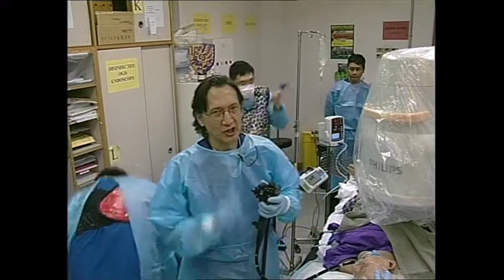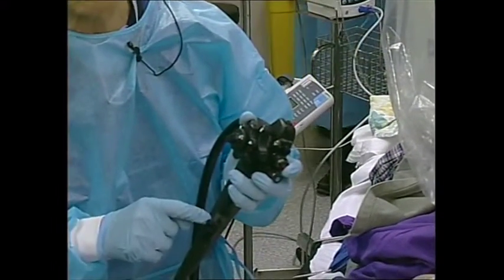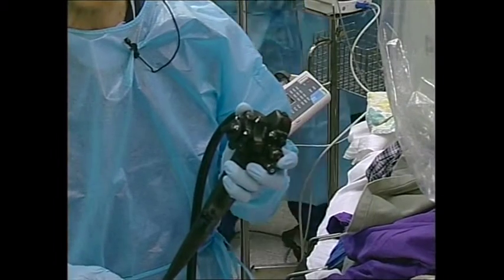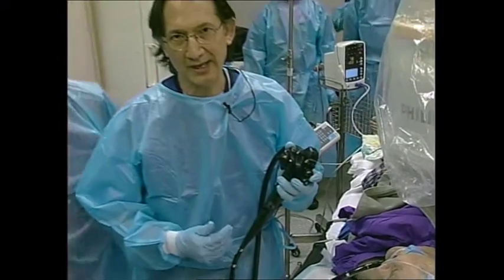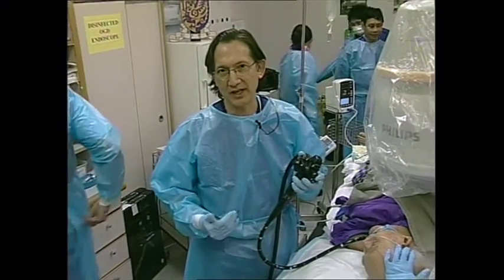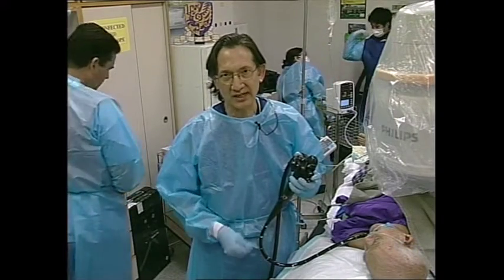Good afternoon. I just inserted the echoendoscope, and this is a therapeutic curved linear array echoendoscope. The reason why we've selected the therapeutic with the large channel, it's 3.7 millimeters, is because we may be inserting a stent to internalize his gallbladder drainage. So right now he has an external drain, and the hope is that we can internalize this today.